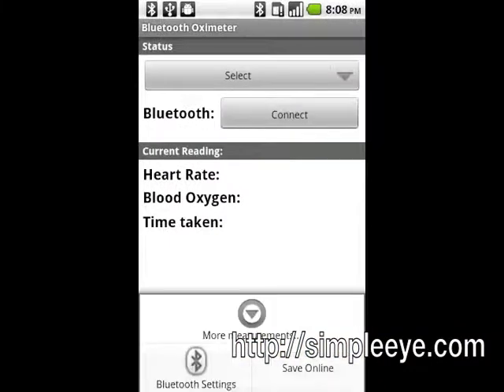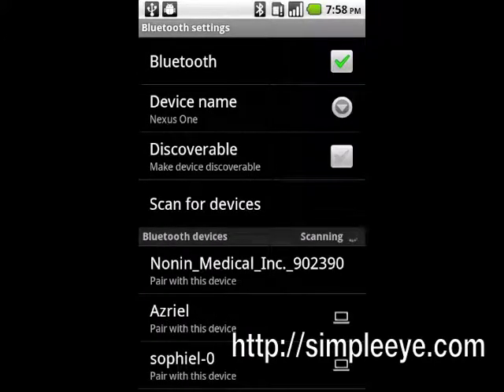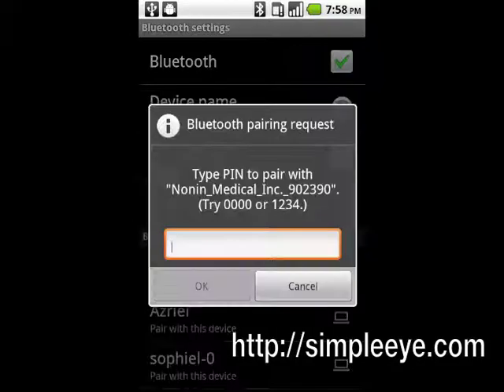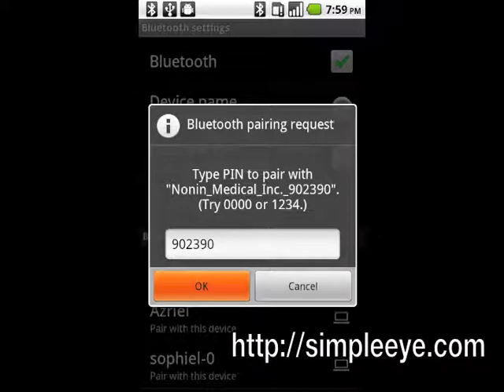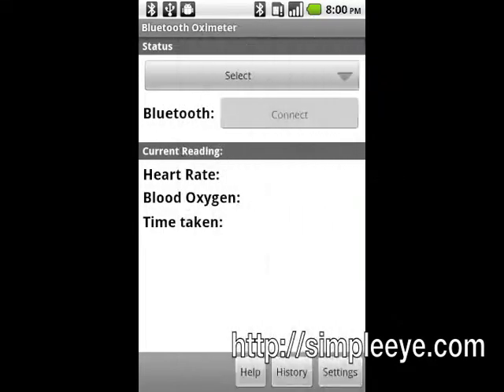Now press the Menu button and tap Bluetooth Settings. The Android Bluetooth Settings screen will show and the pulse oximeter should be found. The caption on the pulse oximeter will show 'Pair with this device.' Tap the pulse oximeter and enter the pairing code. For the Nonin Bluetooth pulse oximeter, this is the last six digits of the name. Tap OK to complete the pairing. The pulse oximeter caption will change to 'paired but not connected.'